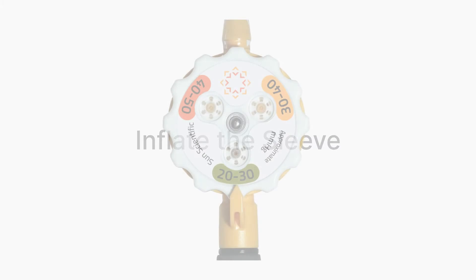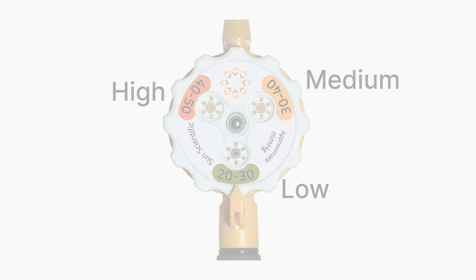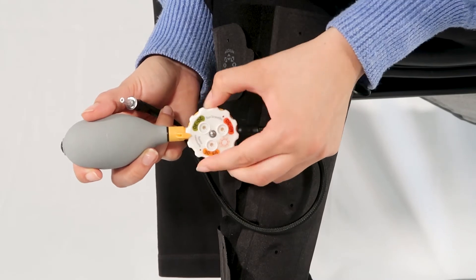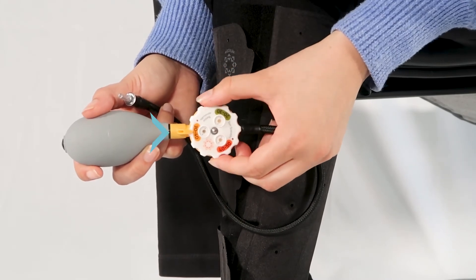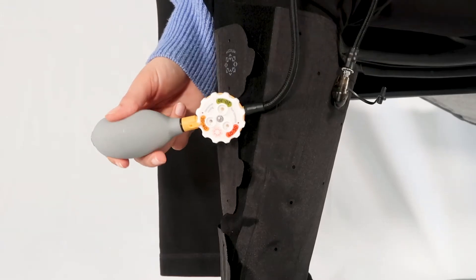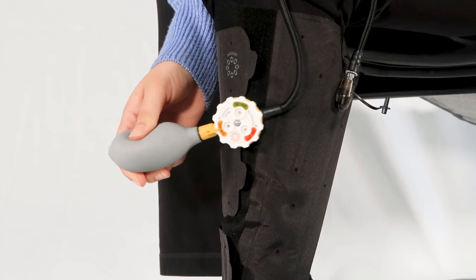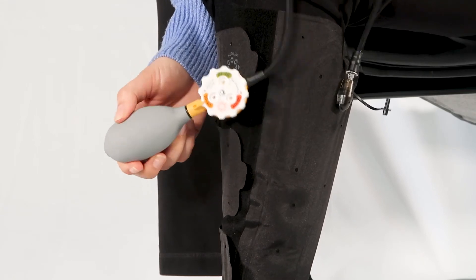AeroWrap inflates to provide inelastic air compression. To begin, locate the AeroGauge hand pump and spin the dial until the selector points to the middle of the desired compression range. Insert the tip of the pump into the valve and slowly squeeze the pump 10 to 15 times to fully inflate the chamber.